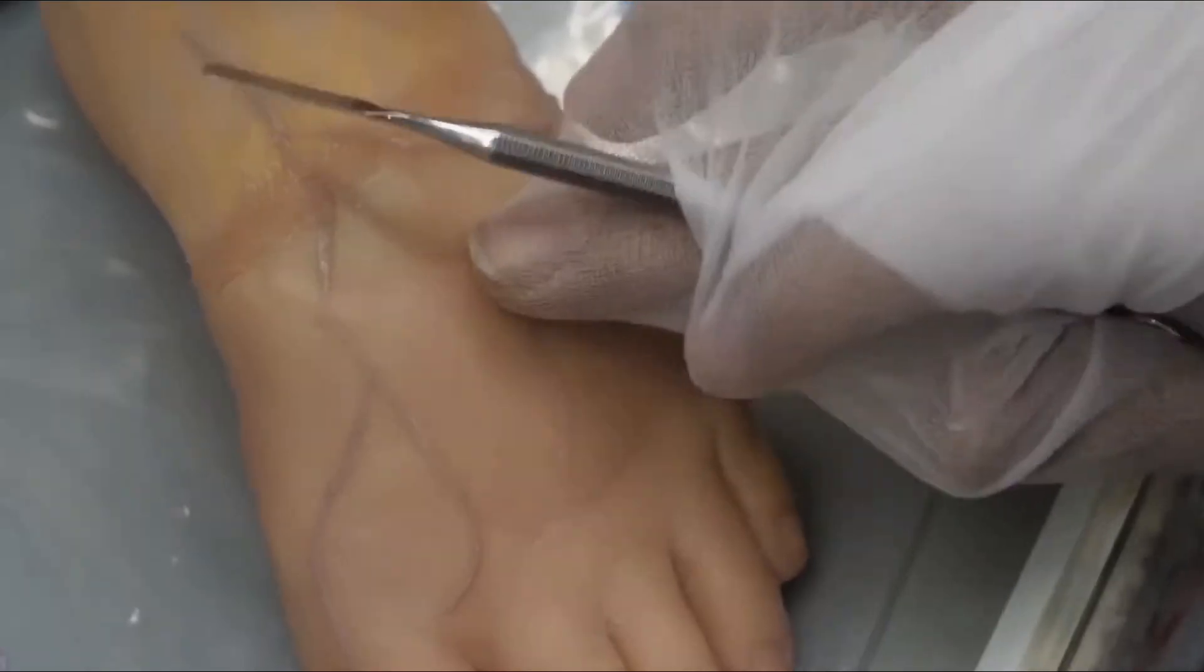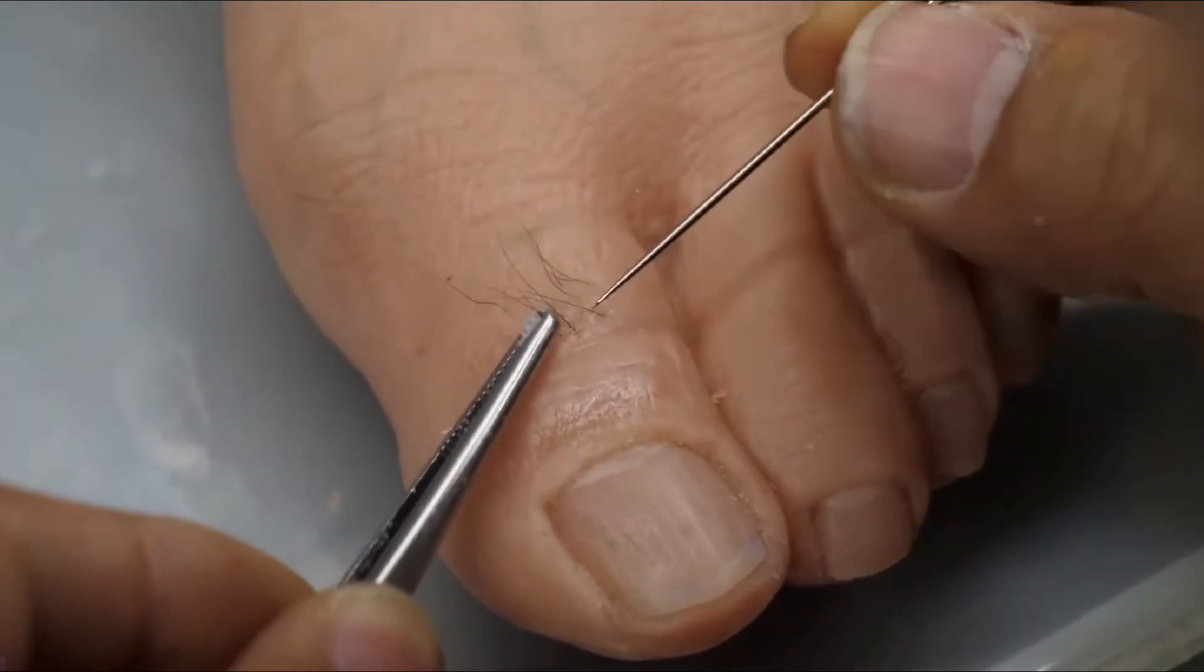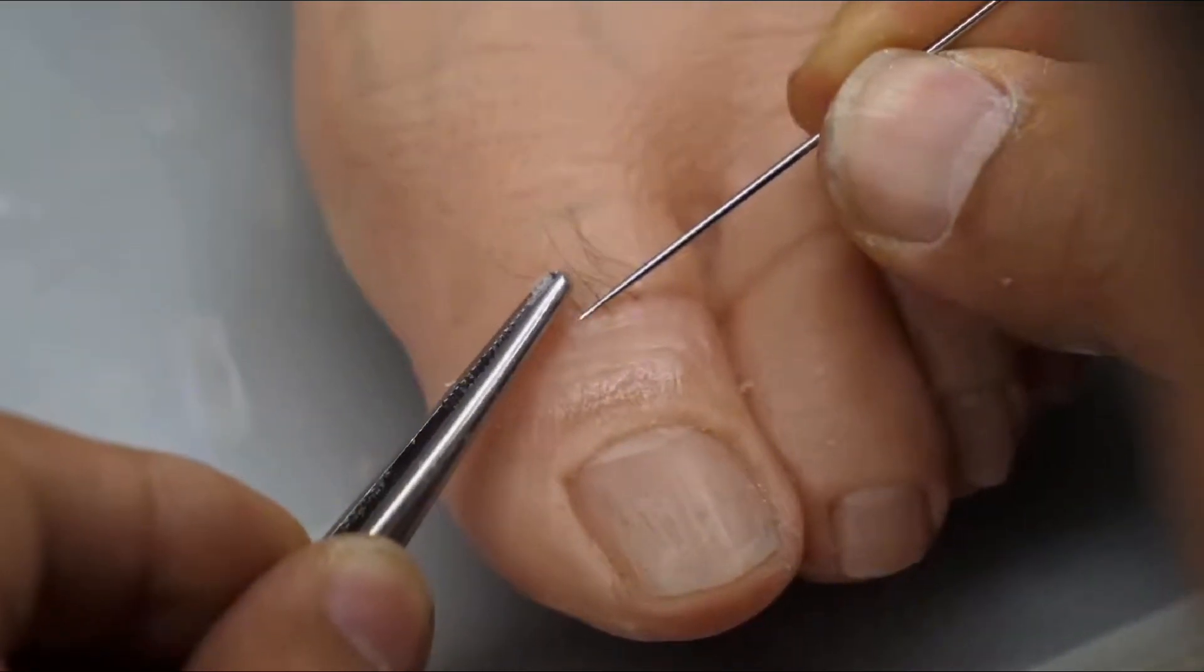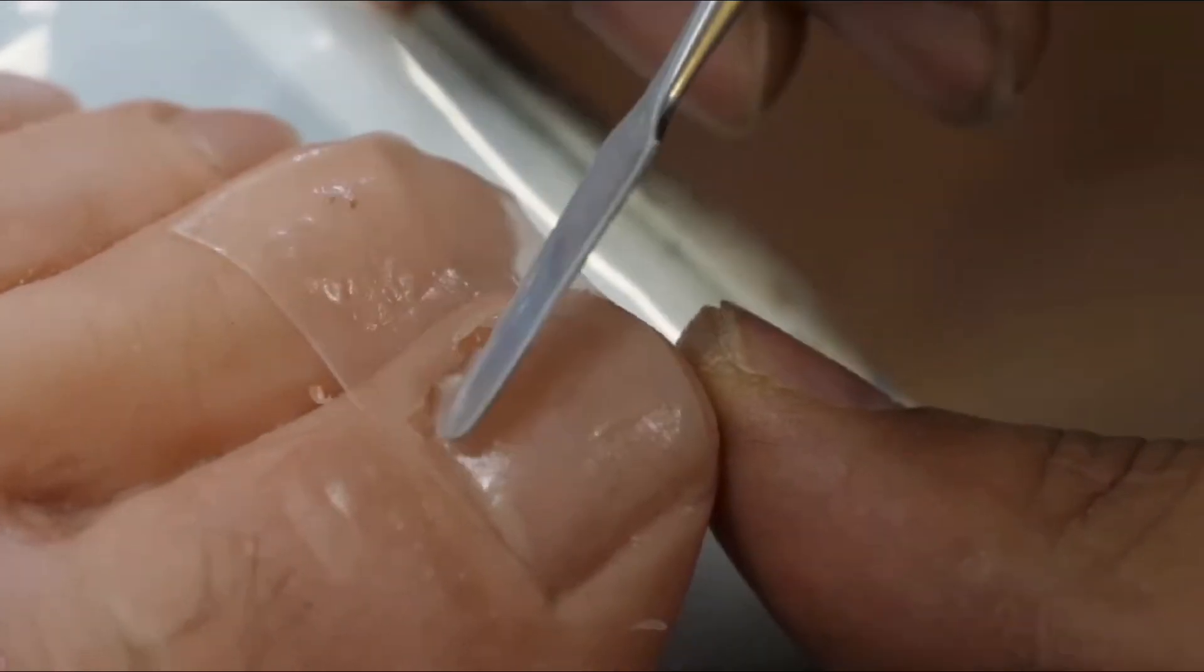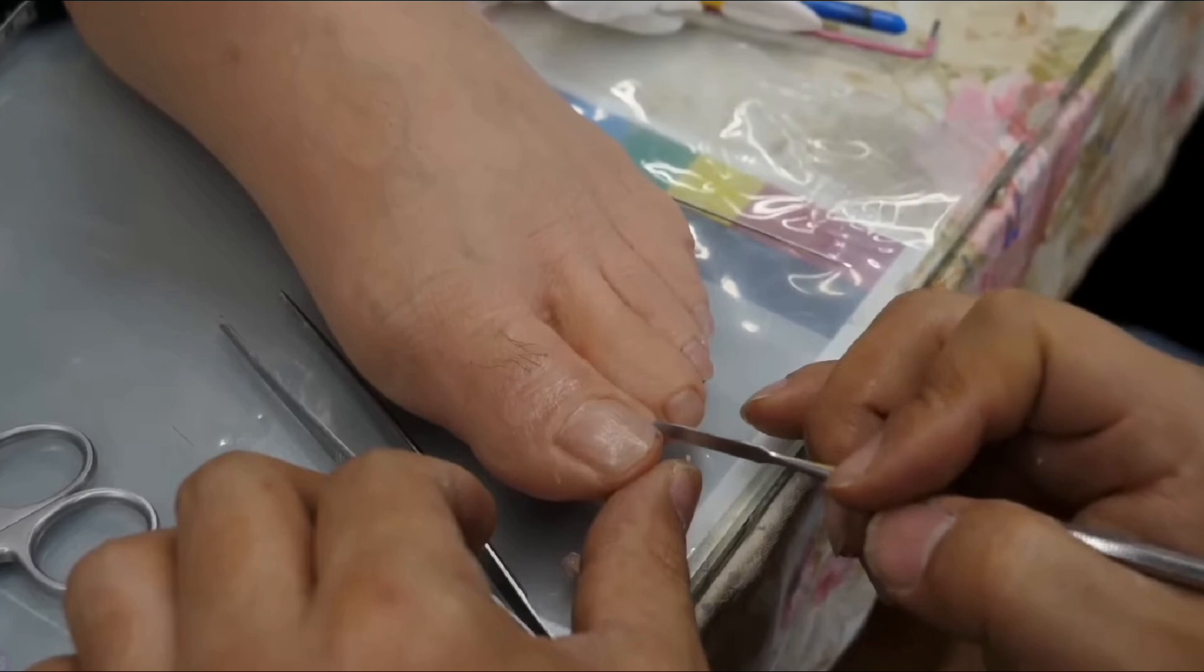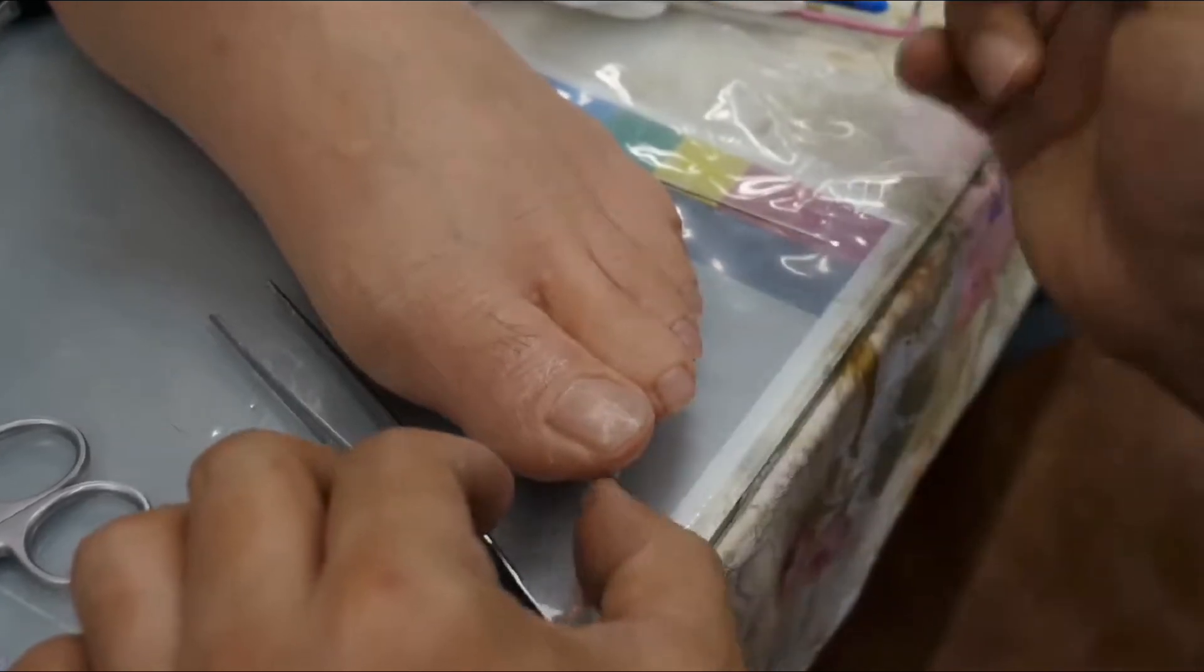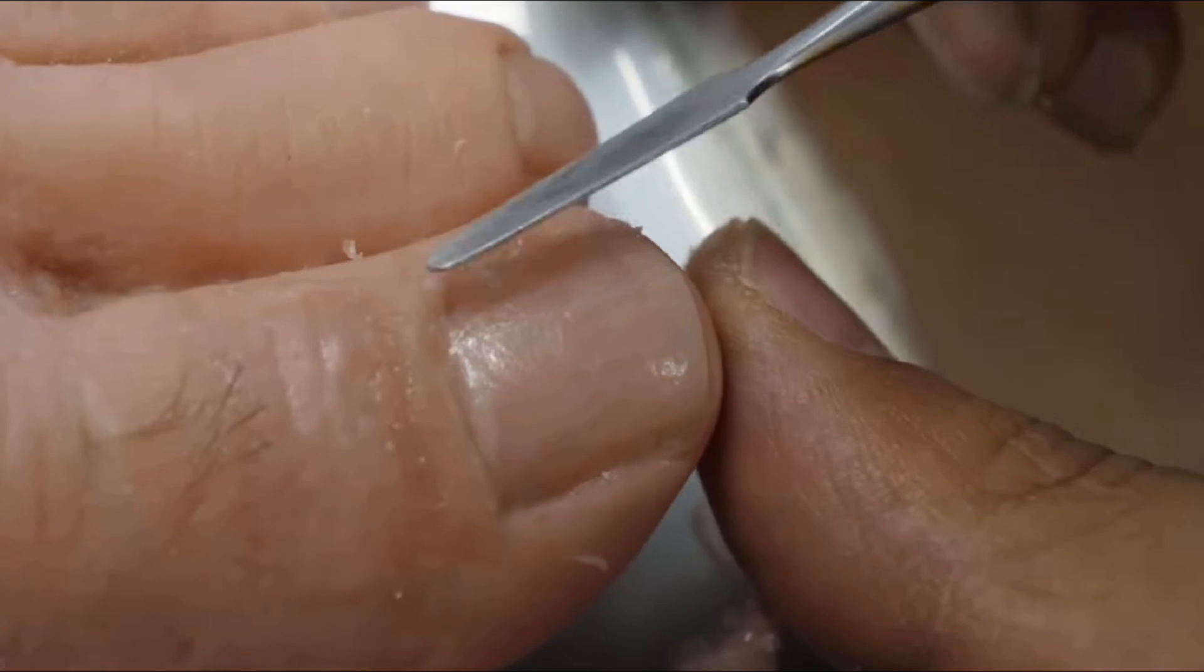In foot prosthetics, a digital scan of the patient's foot captures accurate dimensions for creating a 3D model, ensuring a custom fit. The model is then refined using design software, followed by 3D printing with medical-grade silicone. This additive manufacturing process allows for the creation of intricate details that mimic natural skin.